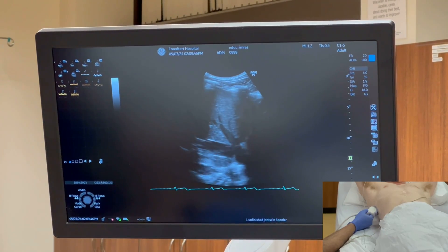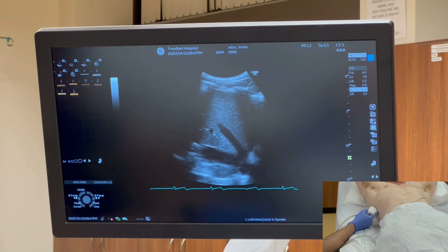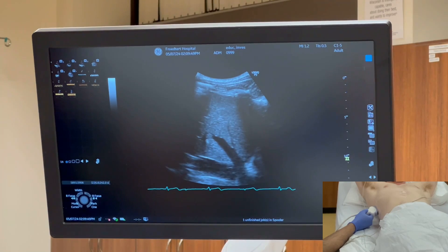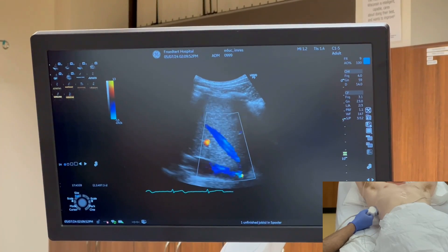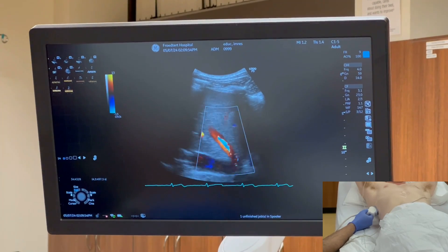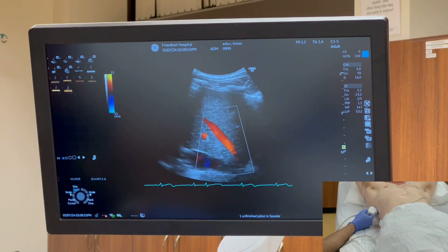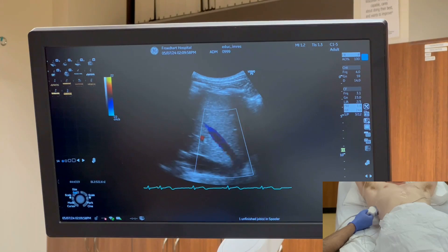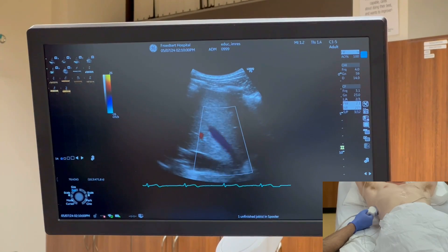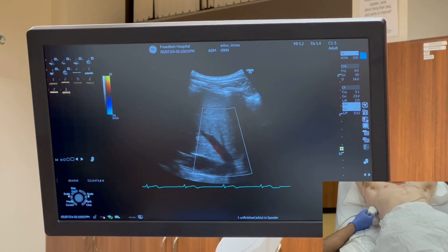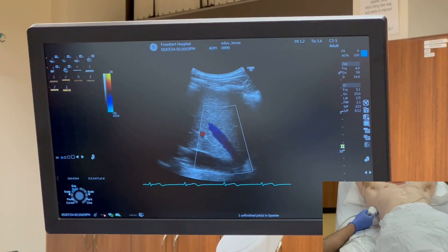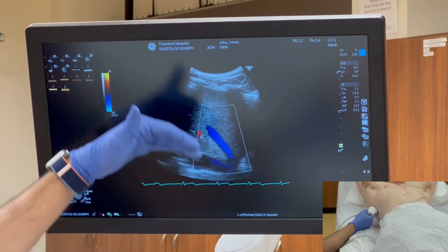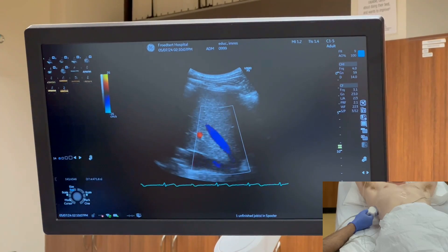Now let's focus on the hepatic vein by reducing the depth and turning on the color Doppler. When I put the color Doppler on, you can see some mixture of colors — it's probably because my scale is set too low. I'm going to increase the scale to about 25 to 30. Now you can see the vessel is mostly blue, conveying that the blood is flowing away from the transducer.